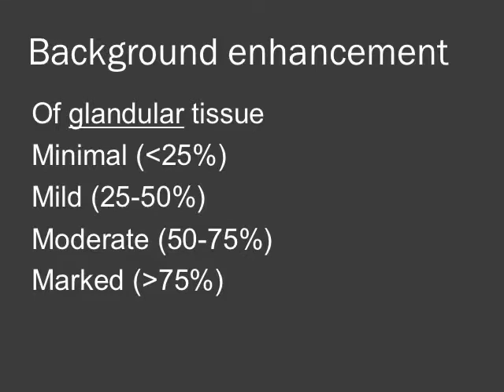You need to make some assessment of the degree of background enhancement — this is the background enhancement of the normal glandular tissue in the breast, quantified into four approximate ratings. There is significant intra- and inter-radiologist variation when assessing this, and they may be changing these in the new BI-RADS. But for the moment it is separated into: minimal, less than 25% of the glandular tissue enhancing; mild, 25 to 50%; moderate, 50 to 75%; and marked, more than 75% of the glandular tissue enhancing. So not the cancer, not the fatty tissue, but the glandular tissue.